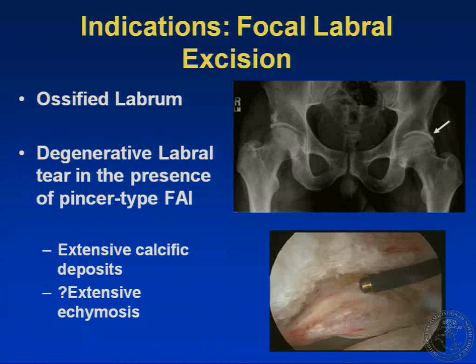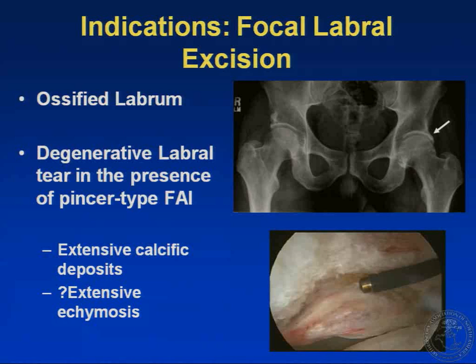The next two videos: the first shows a labrum with intralabral calcification in a patient with pincer-type impingement. We initially attempted a labral takedown but found extensive calcification, so we subsequently debrided it. The second case shows an anterior acetabular rim ossification — in cases where the labrum is ossified, you need to do a rim resection including the labrum, because there is usually not much labrum left to take down.